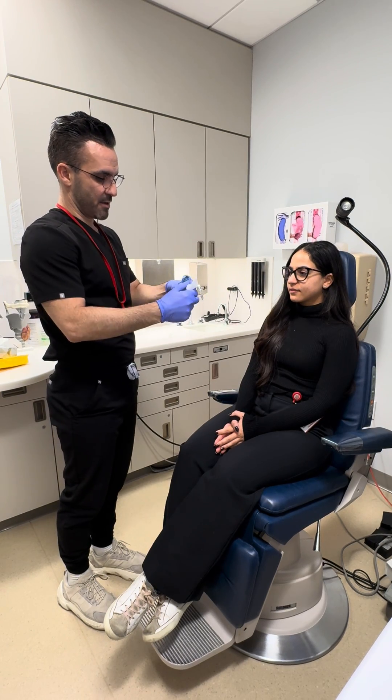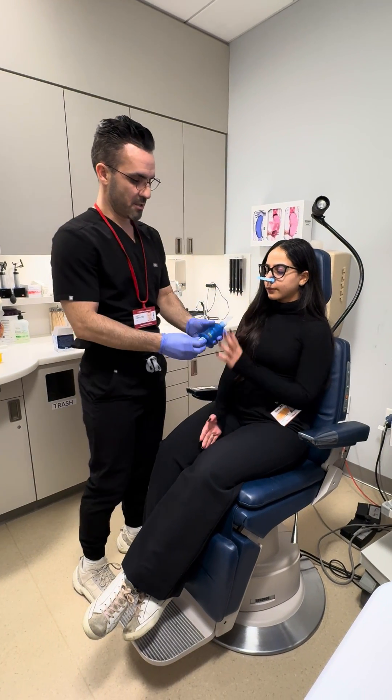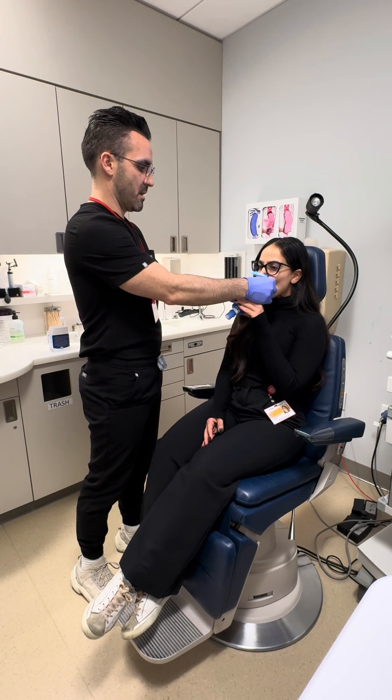Alright, so I have this at the lowest setting right now. Insert this into here, place these nose clips on you. Then hold on to this. Blow all your air — keep going, go, go, go, go. Good, stop. Bite and suck in.